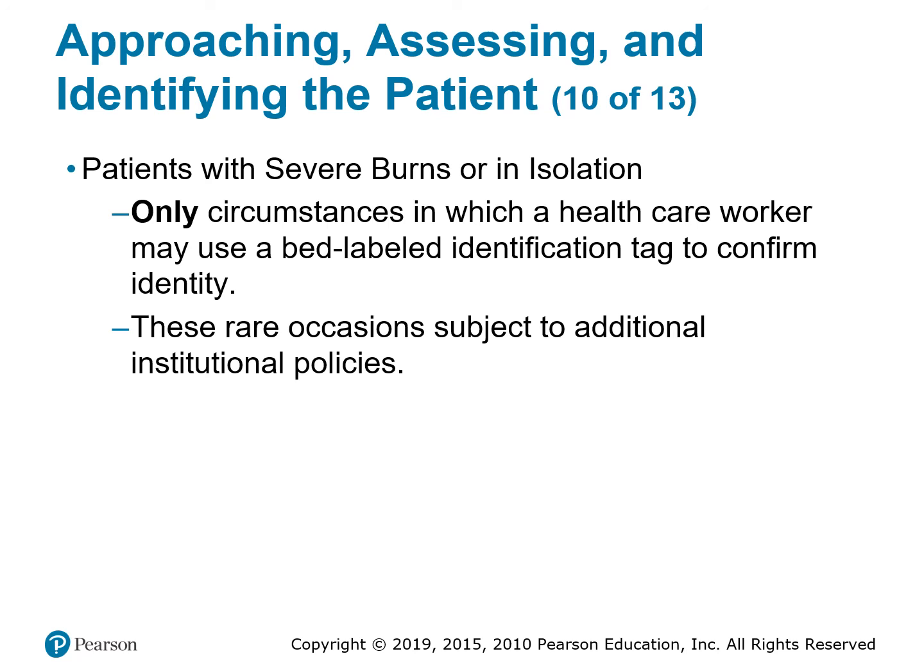No, it's a tag that has the hospital identification number, everything on it, on this patient. But if you can't trust that, or you don't feel comfortable using that, you can always call the nurse to identify the patient. It also depends on how your burn unit works. So there's always a gimme or a catch behind all of it.